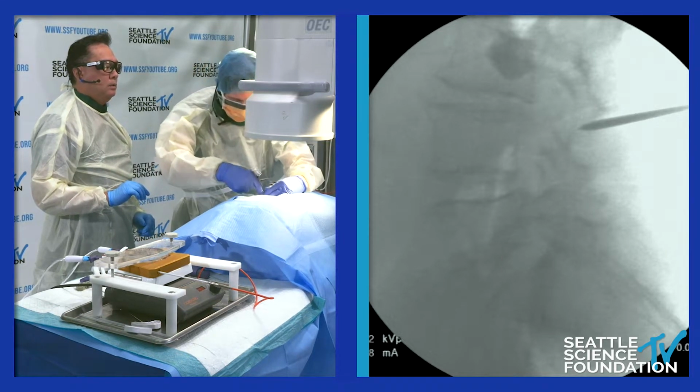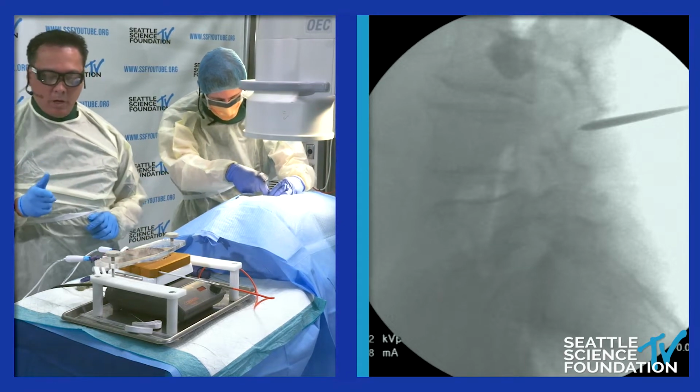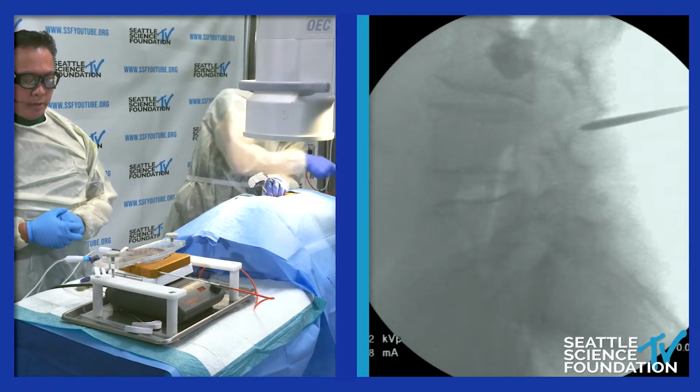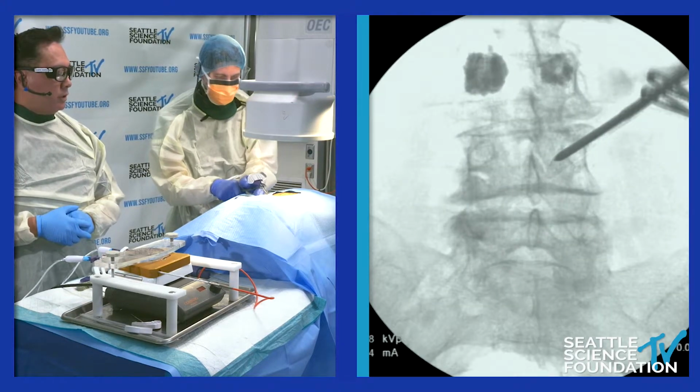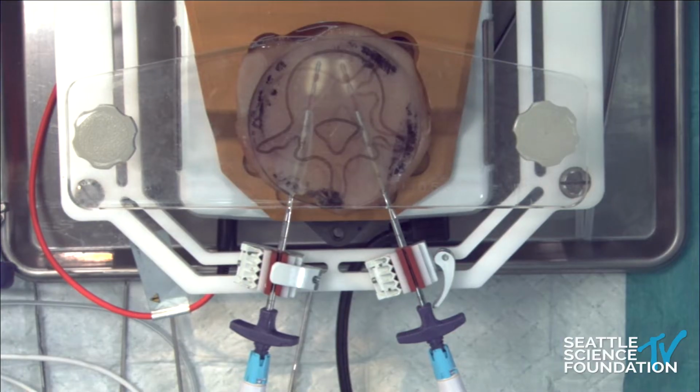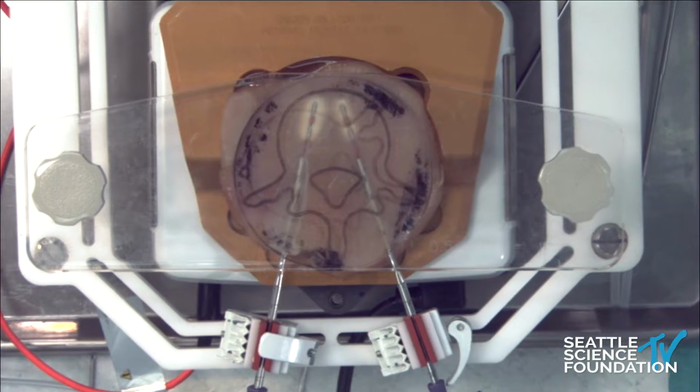So Glen, what's that little machine next to the table? Let's have a little glimpse of the OsteoCool from Medtronic. It's a device which is used to ablate any tumor within the vertebral body. Excellent. So eventually we're going to get our needles and therefore the probes in this fashion here.